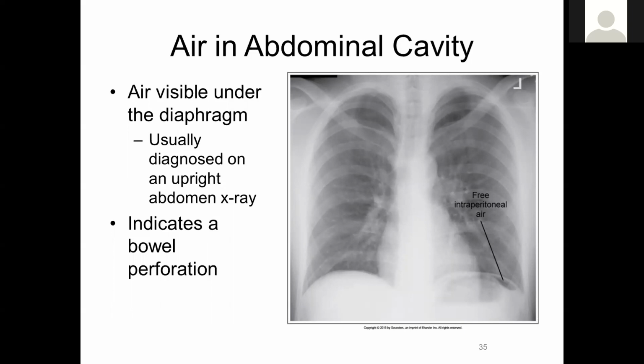This is not good because it indicates a bowel perforation. Your intestinal tract is a closed system. If there's a perforation, air is escaping, you're going to have serious complications and infection as a result.